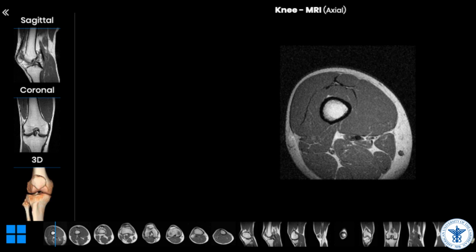On the opposite side, on the middle side, we have the vastus medialis, this wide muscle which occupies the middle side here, the rectus femoris, and this muscle here anteriorly, and just behind, slightly behind here, you can see the sartorius, the gracilis, semimembranosus, and semitendinosus muscles. You see, we are at the upper level of the popliteal fossa.